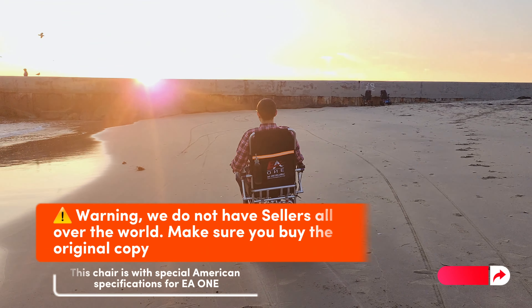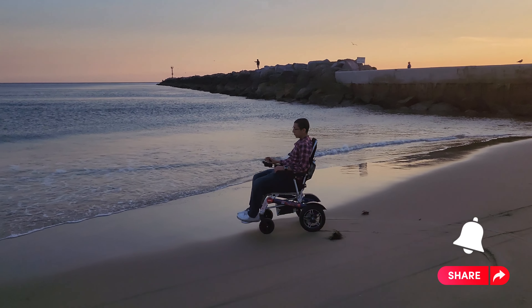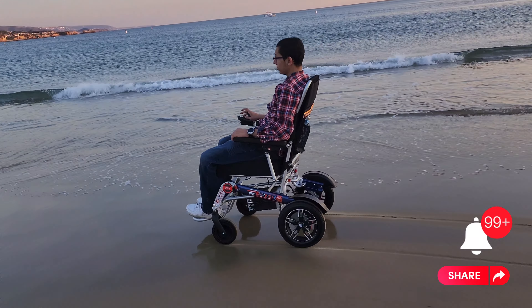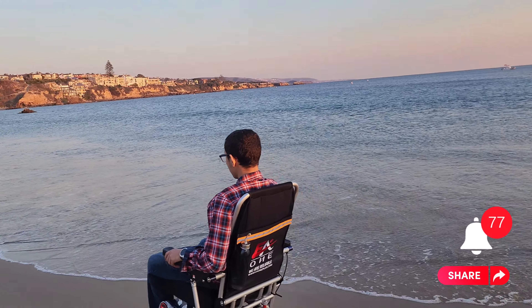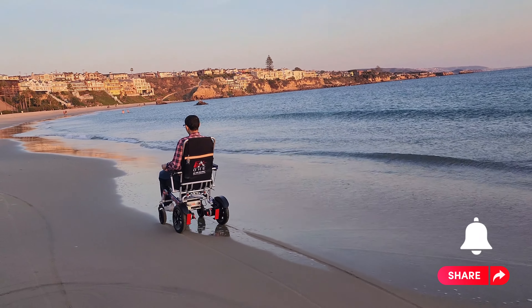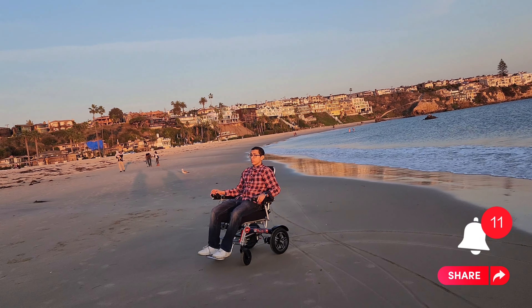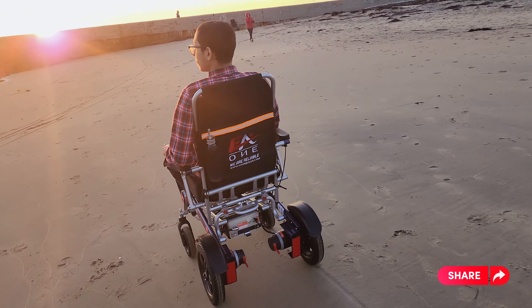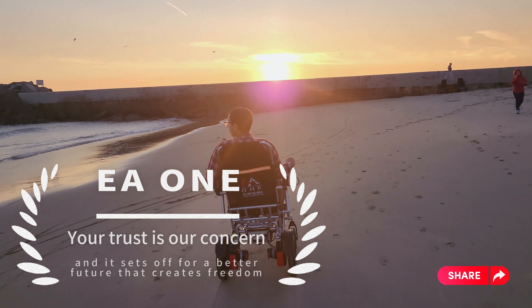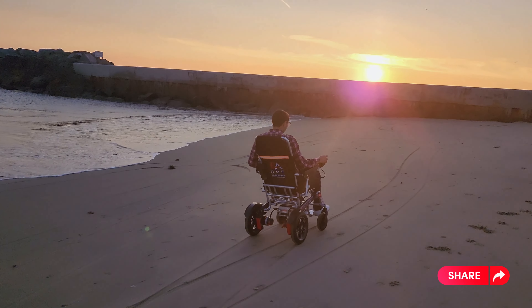Warning: we do not have sellers all over the world. Make sure you buy the original copy — this chair is with special American specifications for EA1. EA1: your trust is our concern, and it sets off for a better future that creates freedom. Enjoy your freedom, EA1!